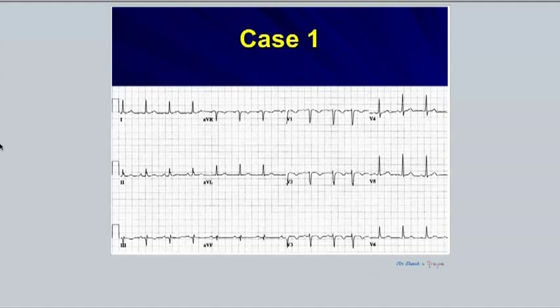And he has T-wave inversions in V1, V2, V3. So very appropriately, cardiology and anyone else taking care of the patient thought he must have anteroseptal ischemia. And that's what 99% of the people in the world would probably look at and think. If we talk about the differential for T-wave inversions in V1, V2, V3, anteroseptal ischemia should jump out at you and make you worried.